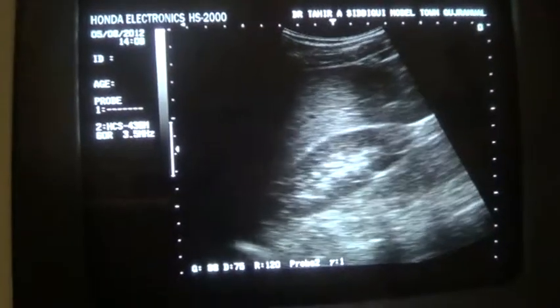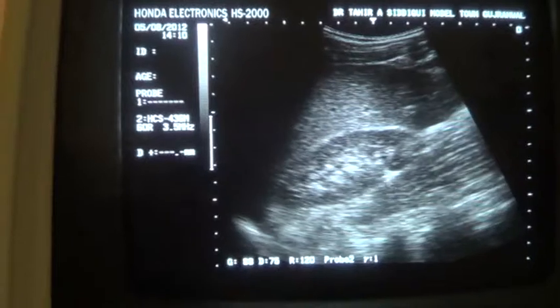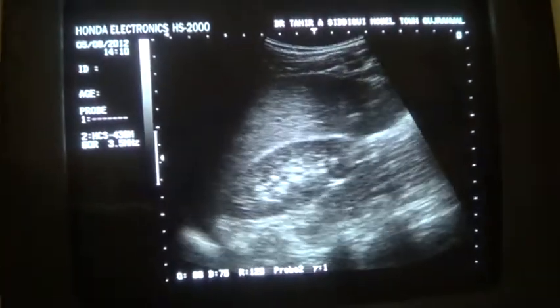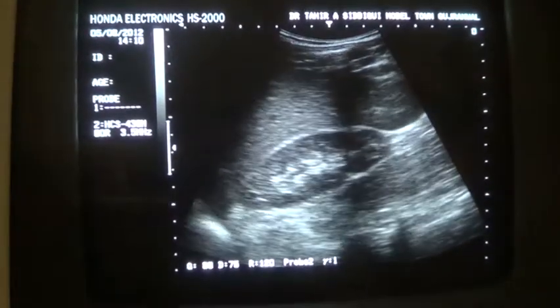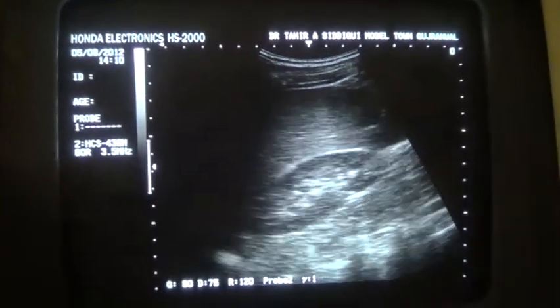Now this is the longitudinal section, and the one thing to take care of, if you can, is that you see the kidney moving with respiration and gliding over the psoas muscle. This is the muscle, and the kidney glides over this muscle. And see where I am. This is my location. This is the subcostal region, and I am in the intercostal space.